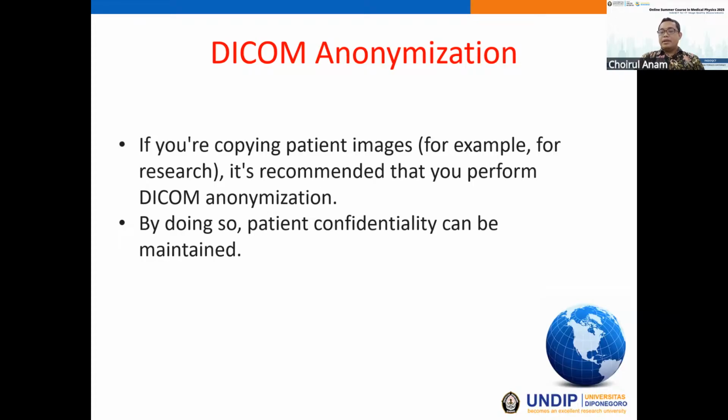And sometimes when we apply for ethical clearance, the committee also requires DICOM anonymization. So it is important for a DICOM viewer to have a feature to anonymize the DICOM information.